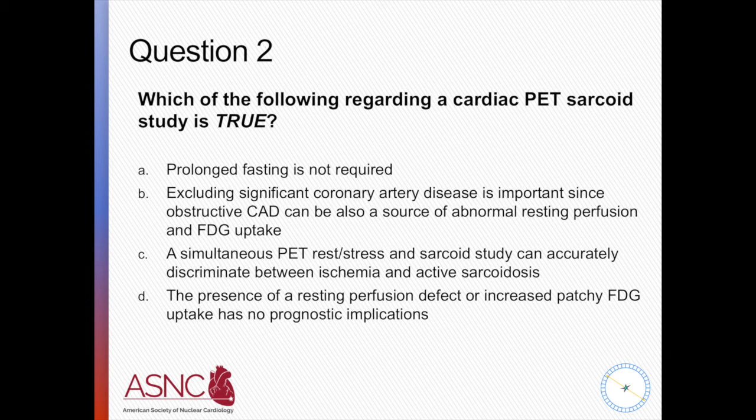Question 2. Which of the following regarding a cardiac PET sarcoid study is true? Option A, prolonged fasting is not required. And we already talked a little bit about this. In contrast to perfusion and viability studies, where you're trying to maximize glucose utilization, in a sarcoid study you're trying to do the opposite. You're trying to minimize glucose utilization in the myocardium, so that any FDG uptake is picked up by the inflammatory cells during active inflammation.